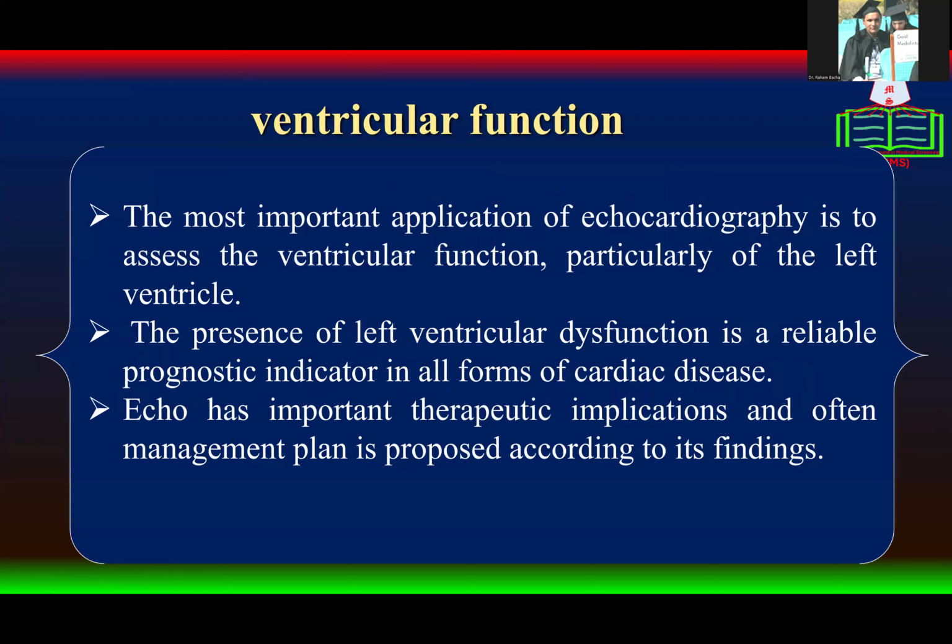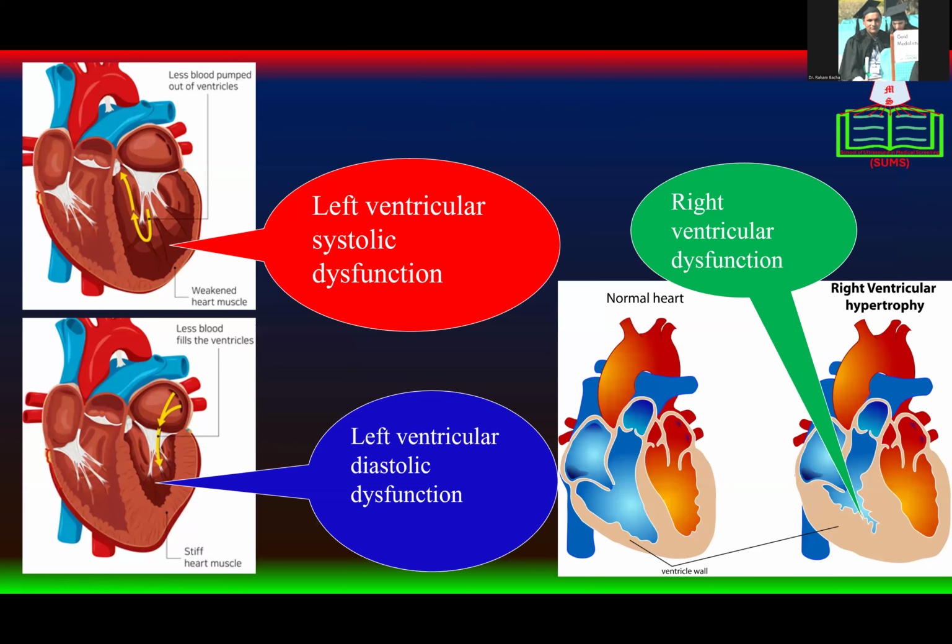So, assessment of ventricular function, particularly of the left ventricle, is the most common and the most important application of echocardiography. The presence of left ventricular dysfunction is a reliable prognostic indicator in all forms of cardiac disease. It has important therapeutic implications, and most of the time, clinical management is altered when an abnormality of ventricular function is detected.